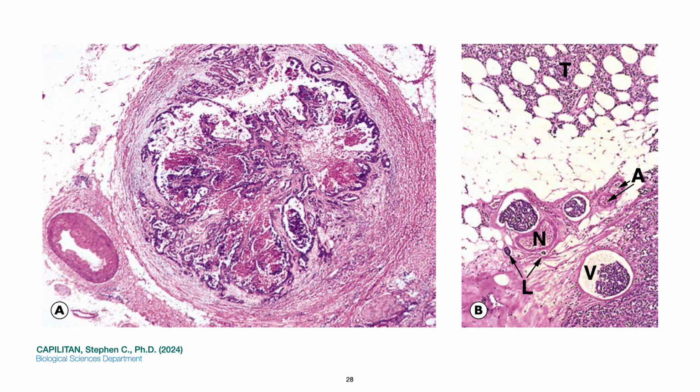This is hematogenous spread of malignant neoplasms. In letter A, that's a malignant colonic neoplasm in medium power. In letter B, that's a malignant breast neoplasm. In A, it shows a large serosal vein from a colon in which there was an extensive malignant neoplasm. A solid mass of tumor is growing along the vessel lumen. The site of invasion of the vessel wall was proximal to the section and therefore cannot be seen.